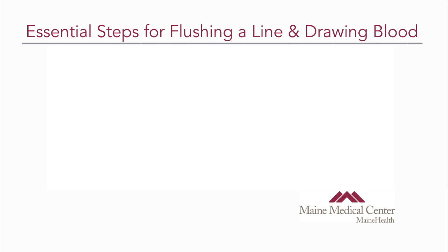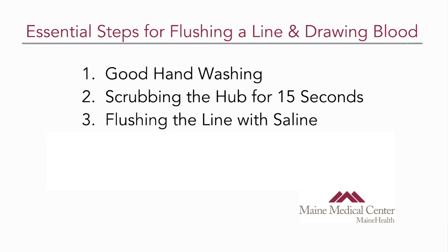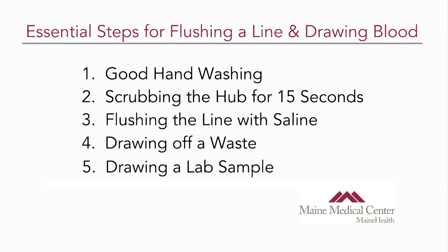Notice that he or she followed all the essential steps: good hand washing, scrubbing the hub for 15 seconds, flushing the line with saline, drawing off a waste, and drawing the lab sample — all essential steps towards properly flushing a line and drawing blood. Most importantly, they did not contaminate by touching the cap to anything after it's been cleaned. If the end of your hub bumps into something, your nurse will perform an additional 15-second scrub prior to attaching it to anything. All of these steps are essential in performing proper line care.